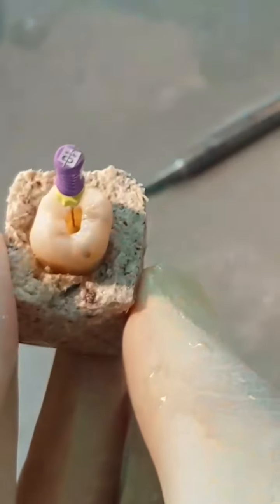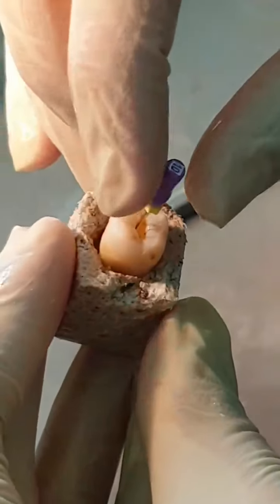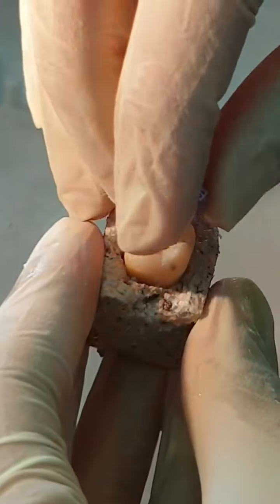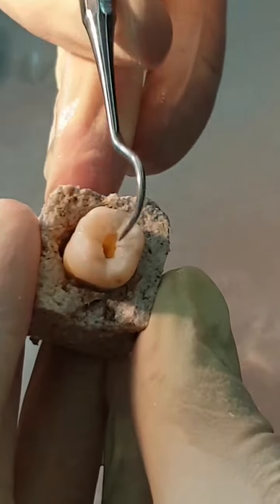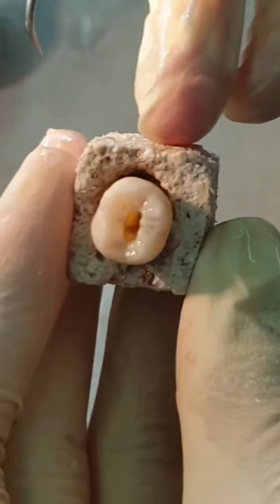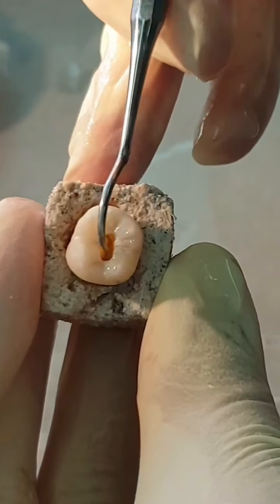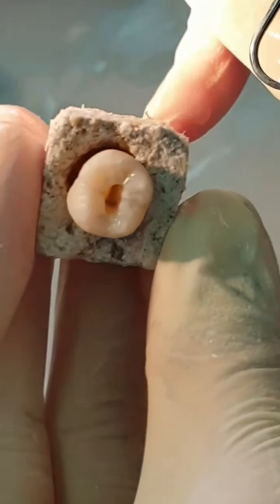But also note the angle that file makes when it enters the canal. In this case, it enters straight and in the center. But if it enters buccally or lingually, you may have 2 or even 3 canals that have just one orifice. And again, note the floor of the pulp chamber that is darker when we compare it to the dentine. And note those developmental grooves in the floor of the pulp chamber.